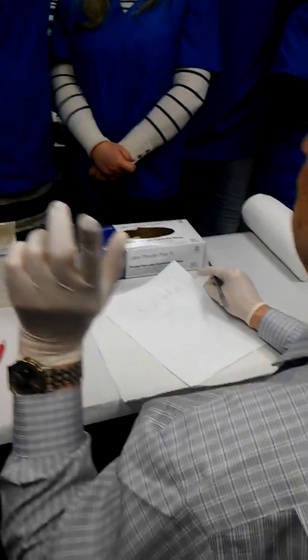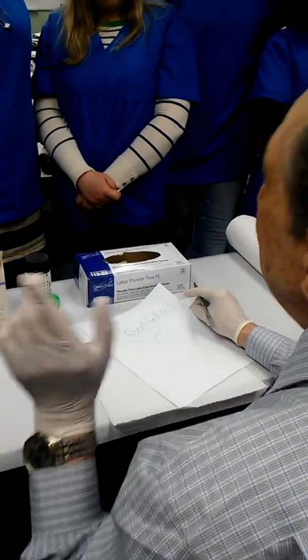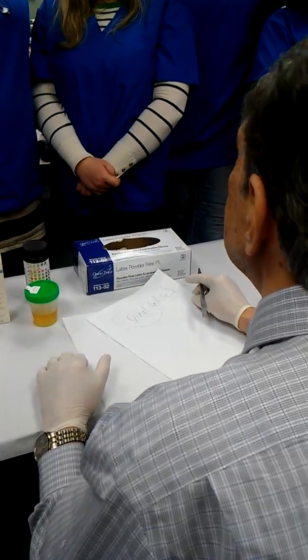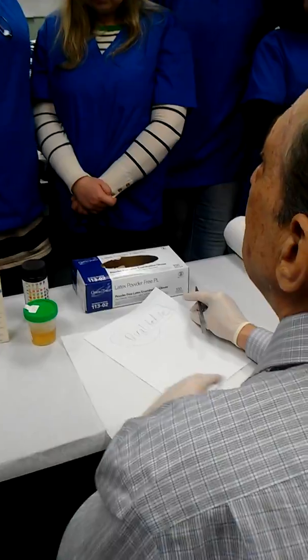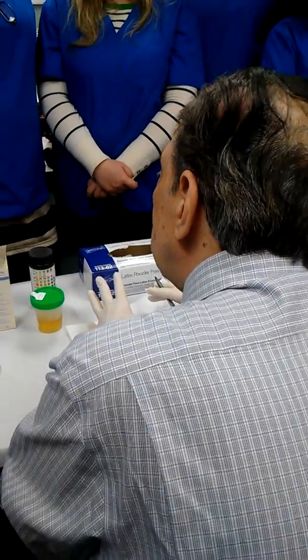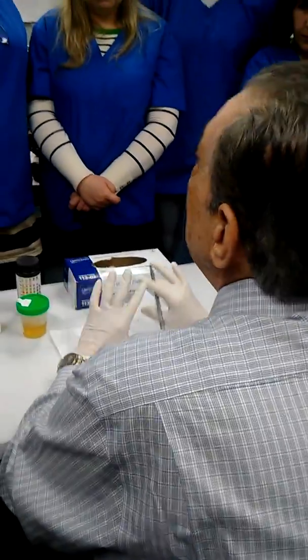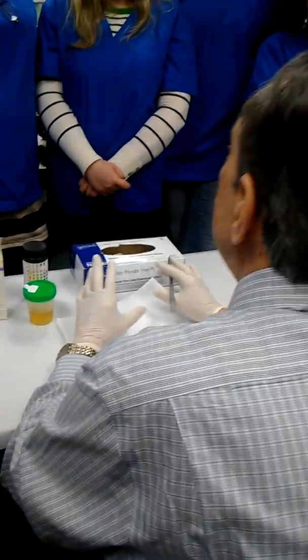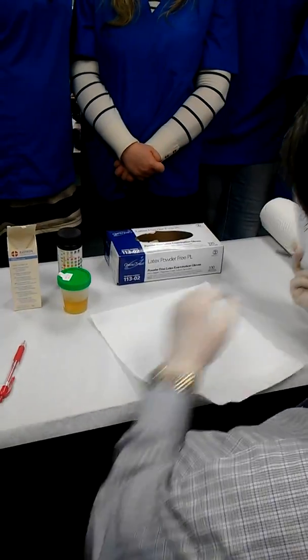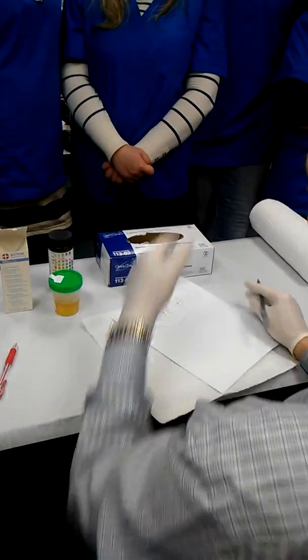This is what laboratory technologists and technicians in the lab do. They will do complete urinalysis. This is not complete. This is just screening, means you have to find out what substances you have in the urine, and that's it, right? That's why it's cheap, that's why it's quick, and we call it screening, and we call it qualitative.